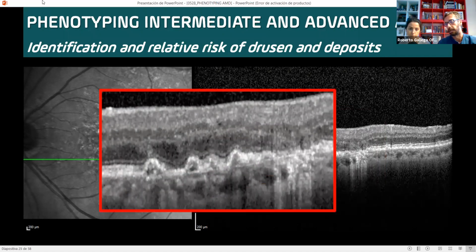So I can see here an almost normal drusen. Your hyperreflective calcified drusen, and you have atrophy, RPE and outer retinal atrophy established there. All these signs are intermediate AMD as far as the atrophy is not located at the fovea. Do you think that's fair for this patient? Well, not really.